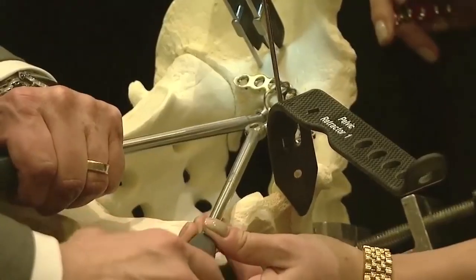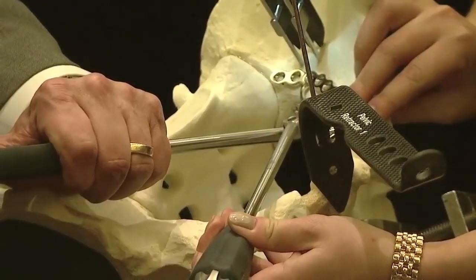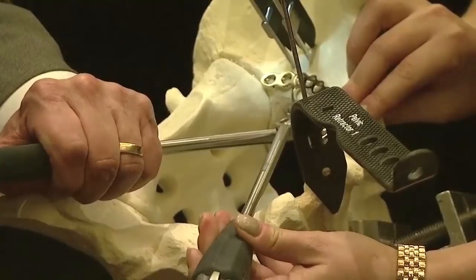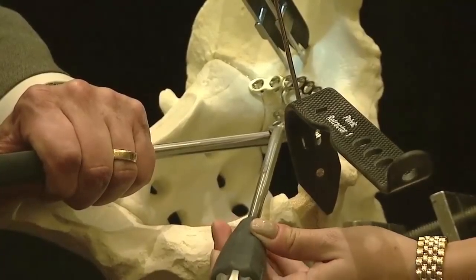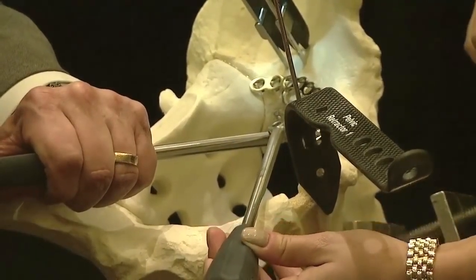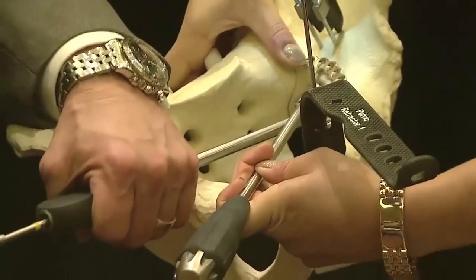Okay, I got it now, Karen. So we'll assume that the plate's sort of where it belongs here. We got it where we like it, and we're going to put a screw in. And again, just as Claude was showing you, we can drill it, if you don't hit the table to your side. Take out the centering sleeve, put the screw in, and then normally we'd use some power to make it a little faster. But again, as Claude showed you, we can screw that in place through the cannulated instruments without having the soft tissue envelope get in the way.